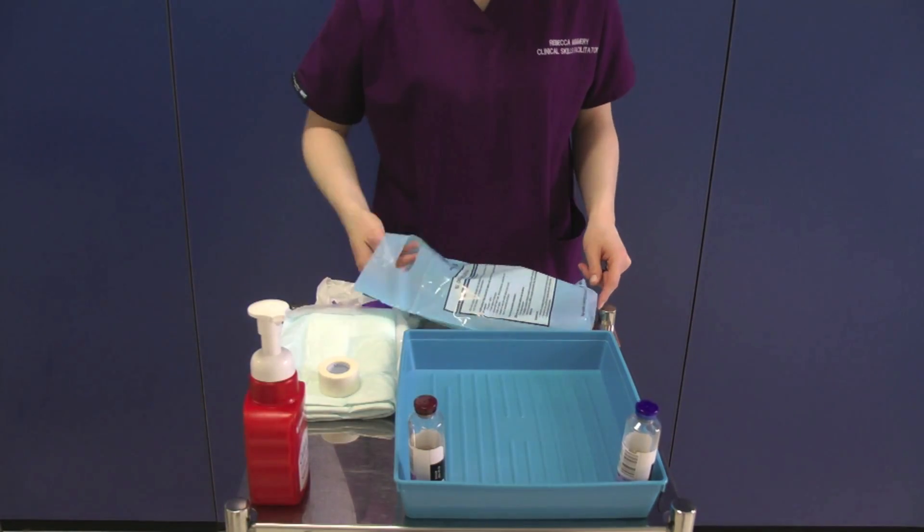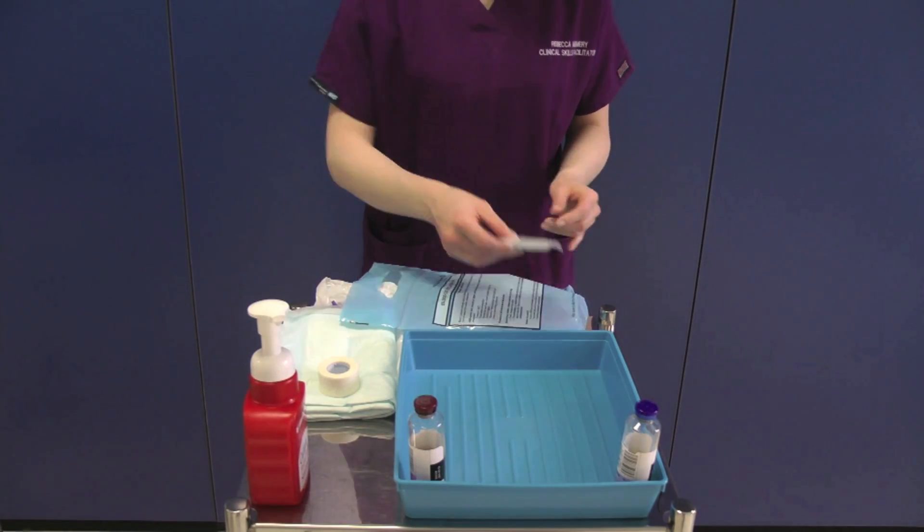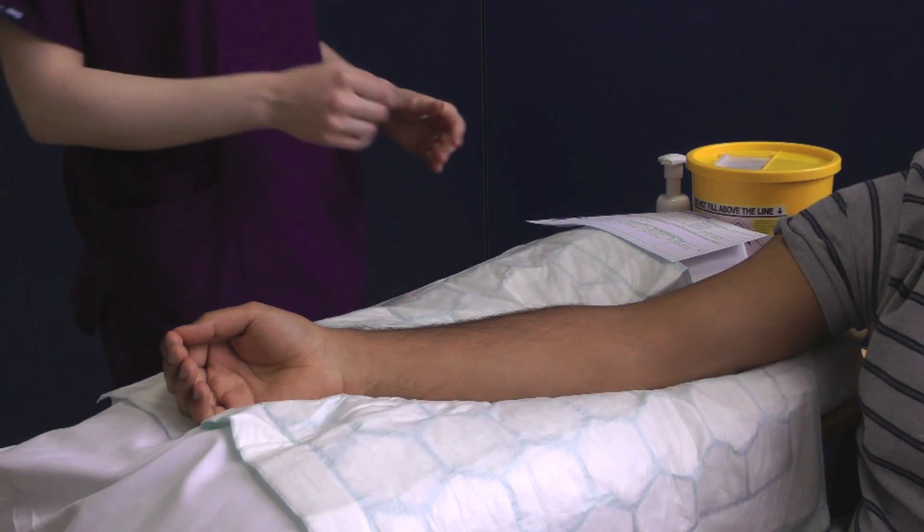Remove the rest of the contents of the blood culture collection bag, checking the expiry dates of the equipment when appropriate. Once you have done this, decontaminate your hands and proceed directly to your patient.